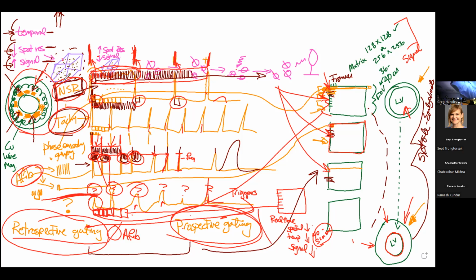But real-time imaging has some headaches. It has lower spatial resolution, lower temporal resolution, and less signal. The pictures are not going to be as bright. You're going to have examples of that as we go through the year. You have to make sure in cardiovascular medicine that you have this 40 to 50 millisecond temporal resolution so that you can appreciate end systole over here and end diastole. And you've got to have enough spatial resolution so that you can clearly demarcate the endocardial surface. Okay.